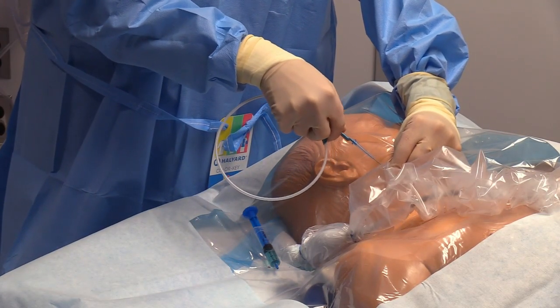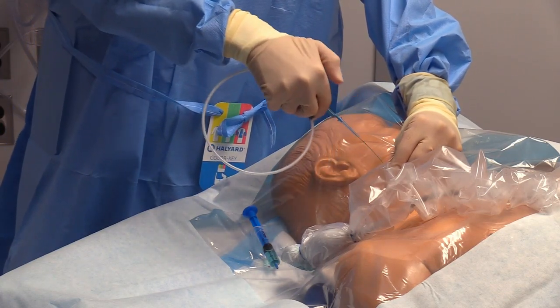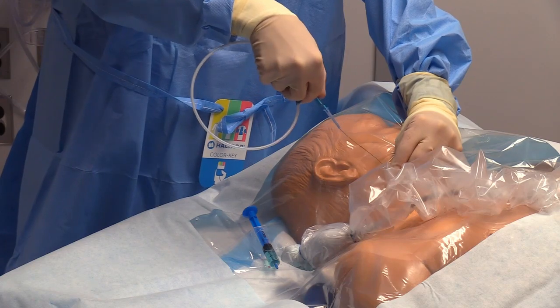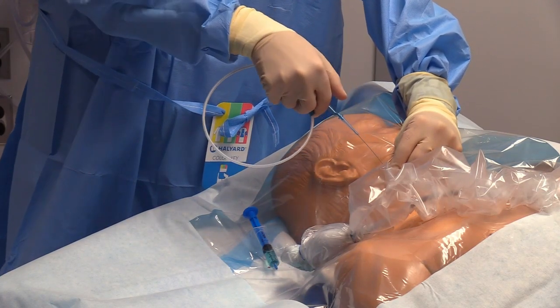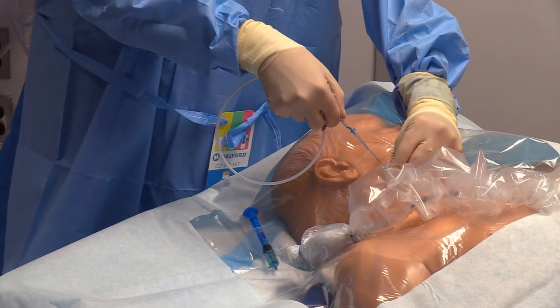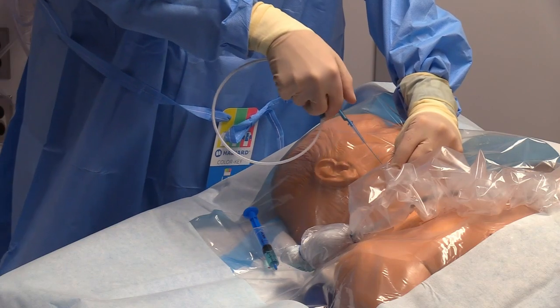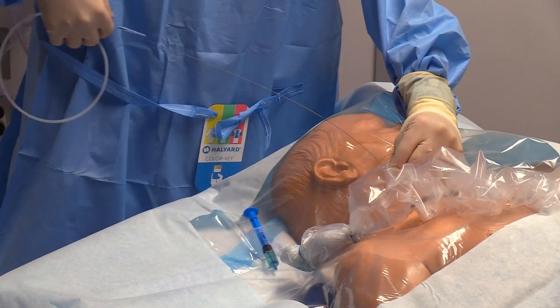What I'd like to do is get to about 10 centimeters, and then I actually pull back my hand with the wire in it, and then push my thumb down and advance the wire in that way. So I actually can feel the wire as it's going in. Not everyone does that. Some people just advance it this way. That's okay too if you do it that way. But I'm just explaining another option of actually feeling it as I'm advancing it. So I can actually feel that it went in, and now it's hitting resistance at about 25 centimeters.